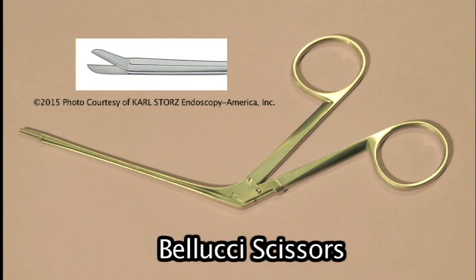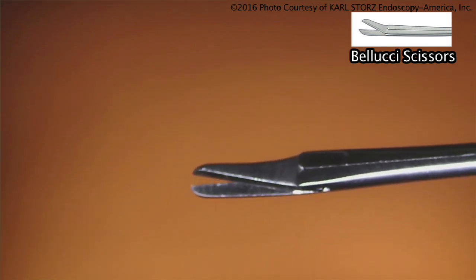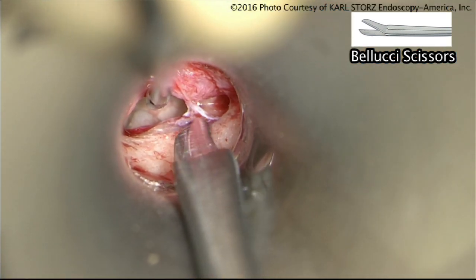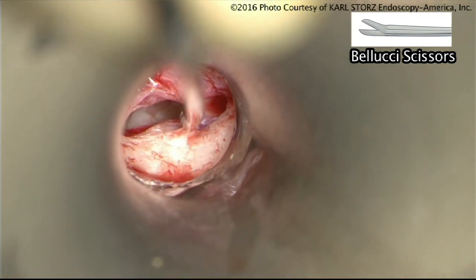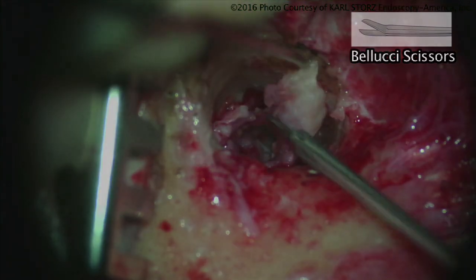Bellucci scissors — Richard Bellucci was an ear surgeon. Bellucci scissors are used for cutting. I also use them in almost a dissecting role at times — I use them to cut the tympanomeatal flap vascular strip portion in a stapes operation in the ear canal. It has a nice flat edge so it can be used to dissect. It's used for cutting the annulus, removing part of the annulus, or removing a diseased portion of the tympanic membrane.